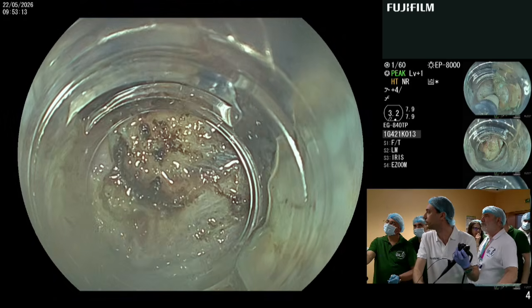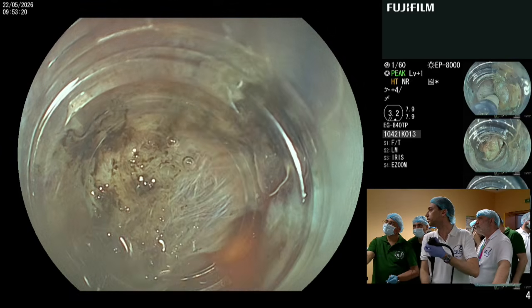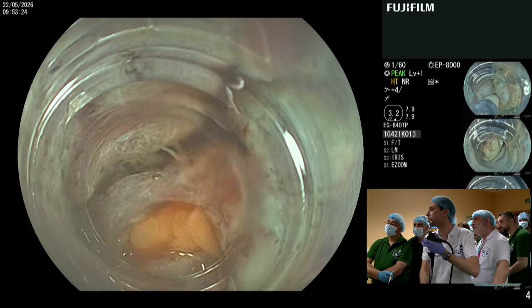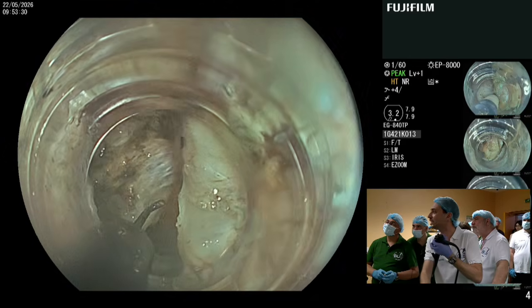Wait, I have to identify the remaining. Yes, here it is. Oops.